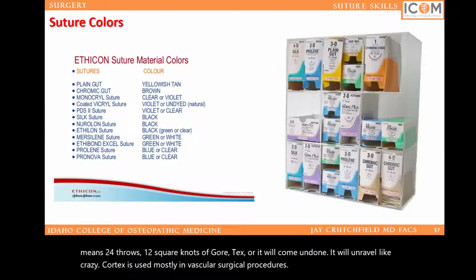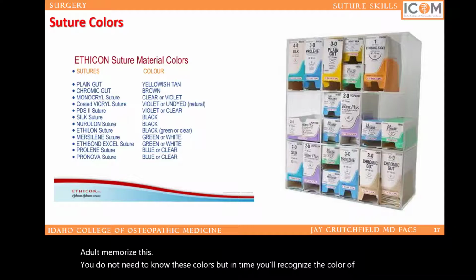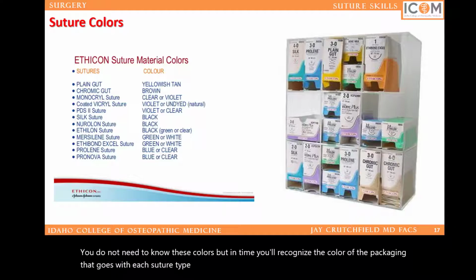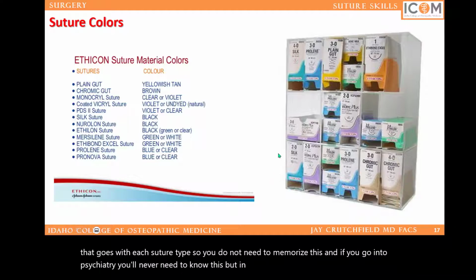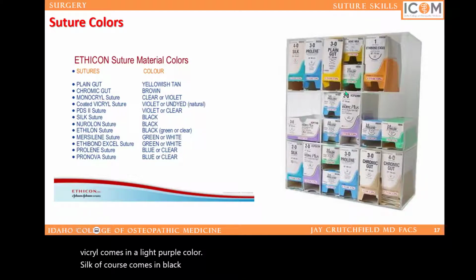Now, don't memorize this. You do not need to know these colors, but in time you'll recognize the color of the packaging that goes with each suture type. So you do not need to memorize this, and if you go into psychiatry, you'll never need to know this. But in the operating room, you kind of get used to the colors of these packages. Chromic gut is sort of this color. Prolene comes in a blue color. Vicryl comes in a light purple color. Silk, of course, comes in black, and Ethilon, which is a nylon, also comes in black. Don't memorize these.